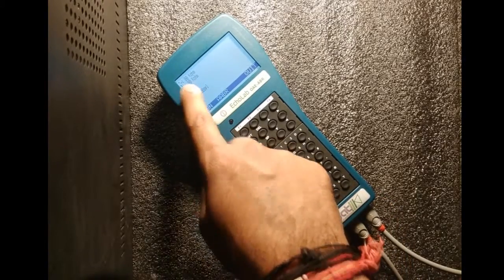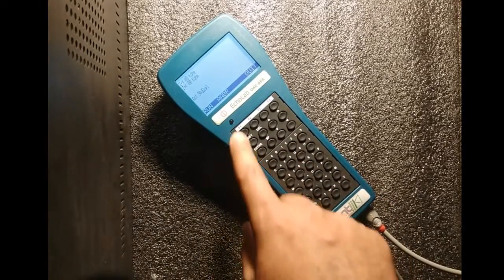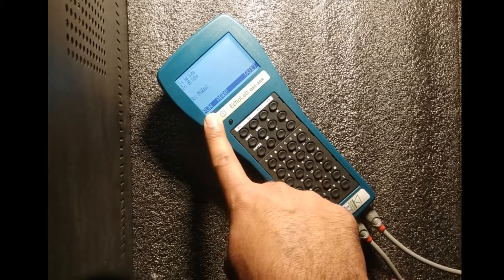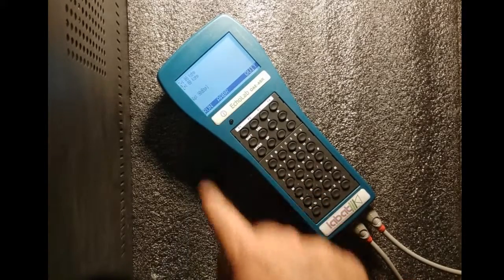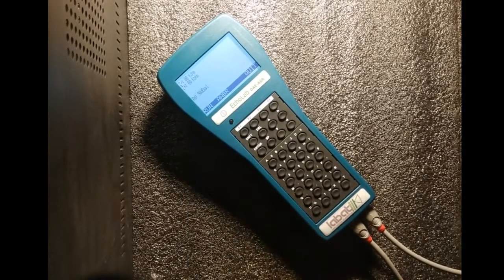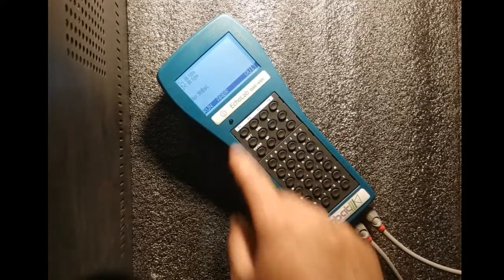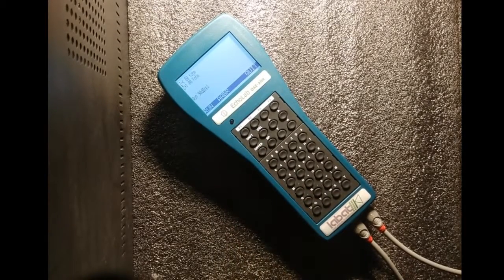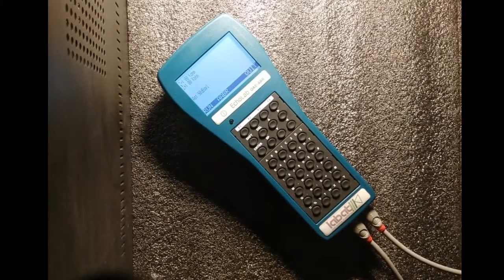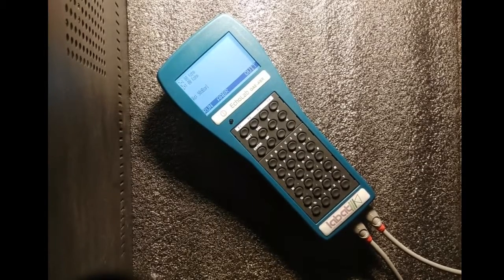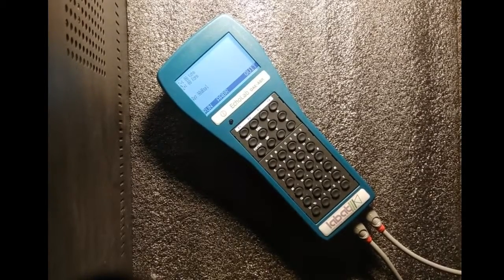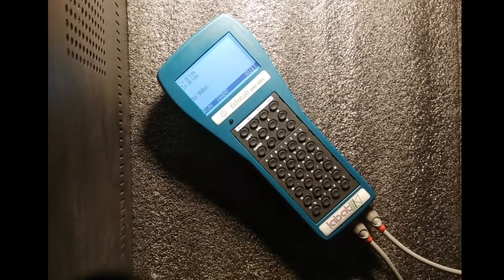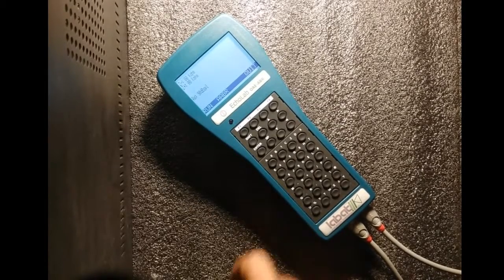We are doing the ABR now, which will give 3000 sum. If we do AABR, it will go up to the point where it matches our preset protocol. Once it matches that preset protocol, it will give the pass or refer result.